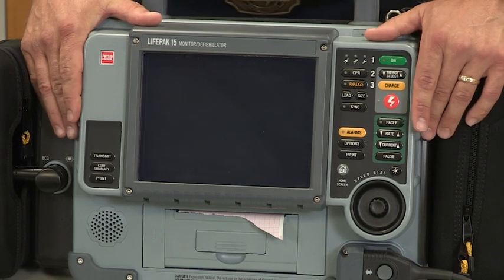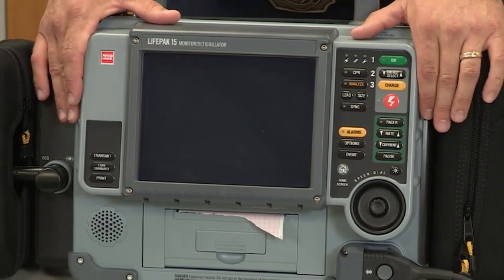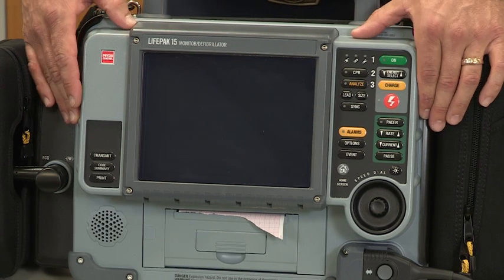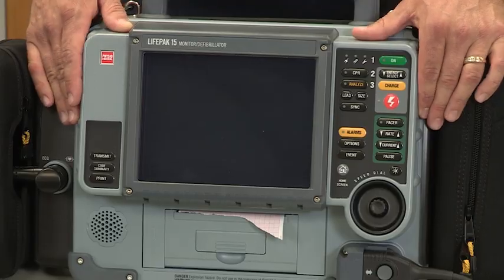Again, this device, LIFEPAK 15, will be set up exactly like the LIFEPAK 12 as far as our protocol and voice prompts go for AED and manual mode.